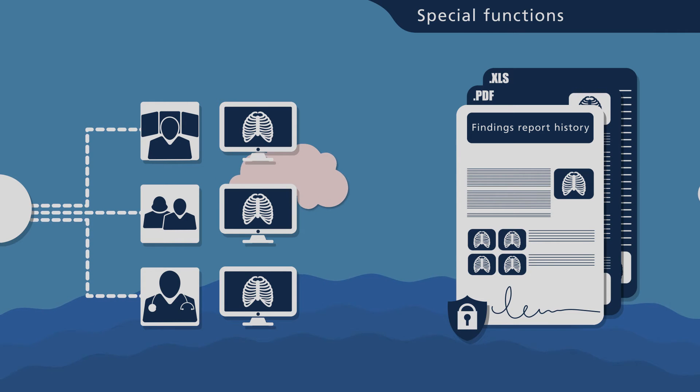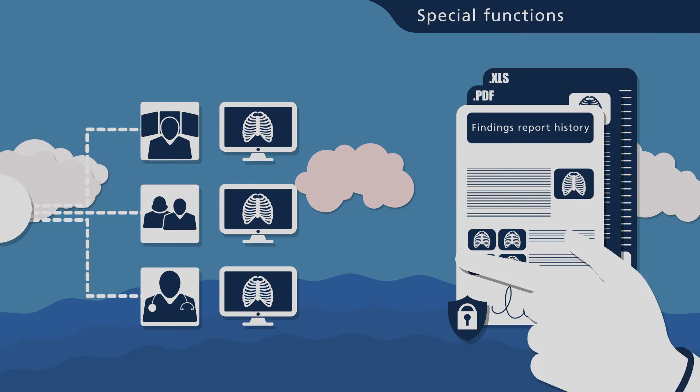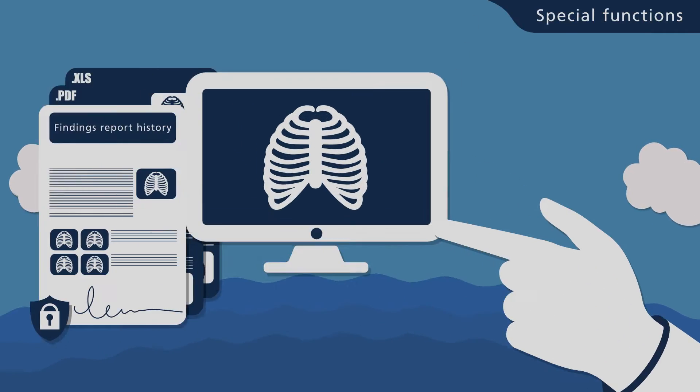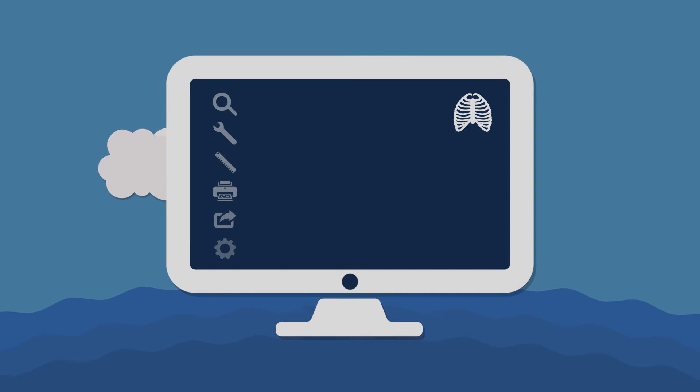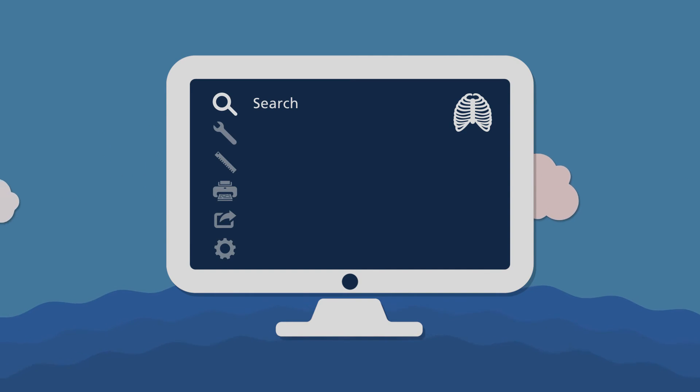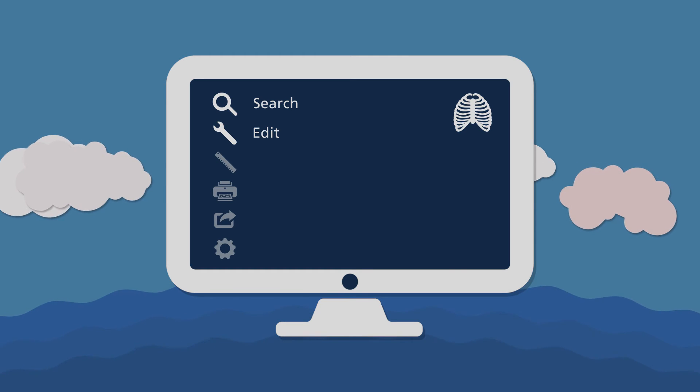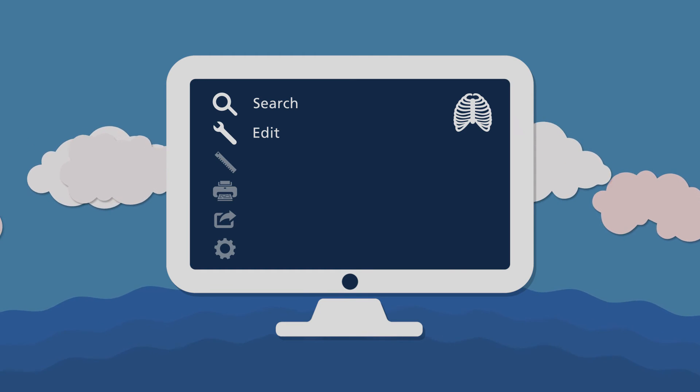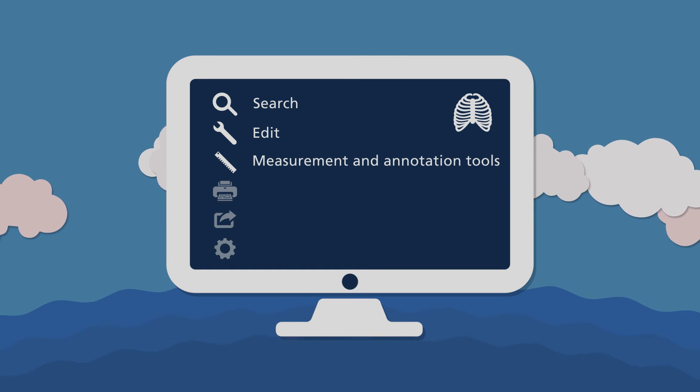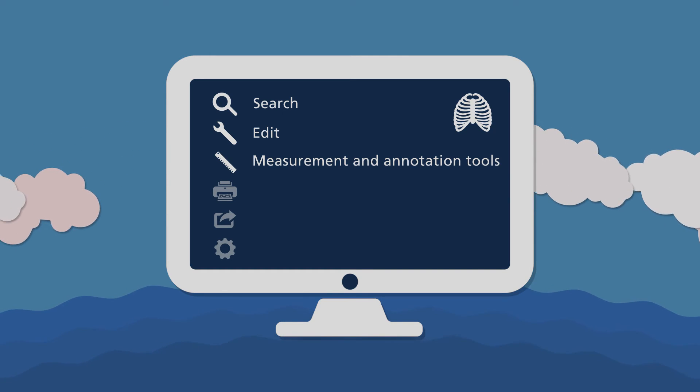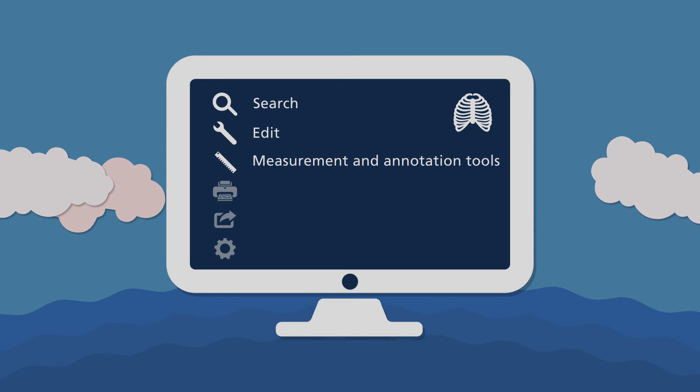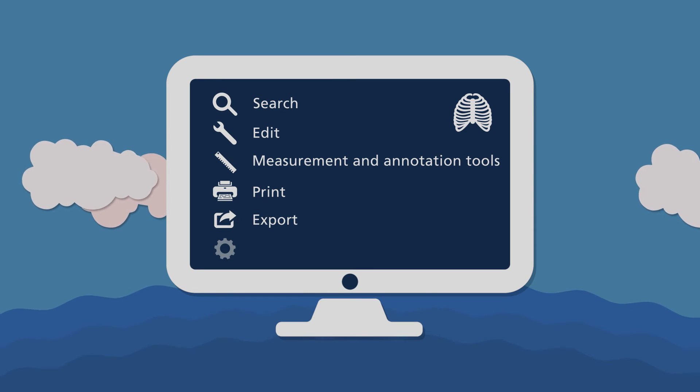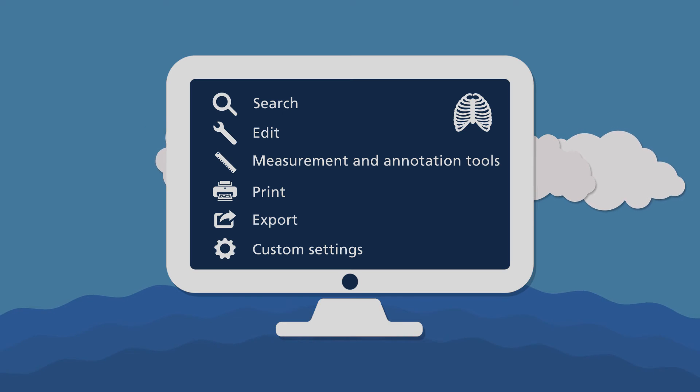Of course, OrcaView provides numerous useful tools. These include a study search function, a wide range of image editing functions, diverse measurement and annotation tools, the ability to print, a study export function with anonymization and custom software settings.